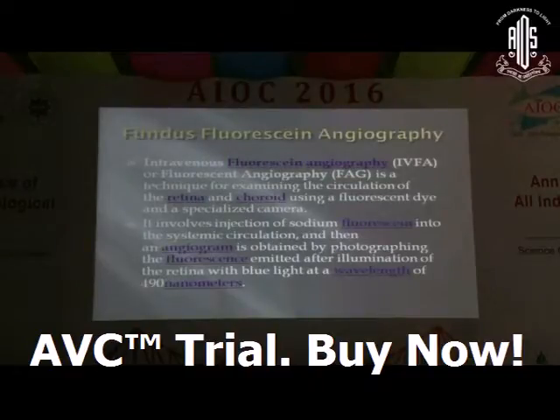Fundus fluorescein angiography, as has already been told in detail, or you can call it fluorescein angiography or intravenous fluorescein angiography, is a modality to view the circulation of the retina and the choroid.